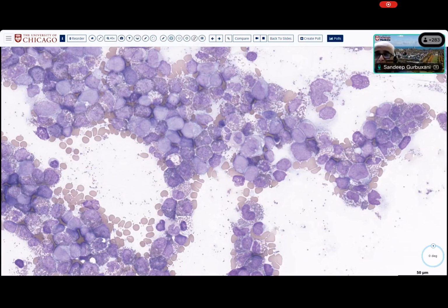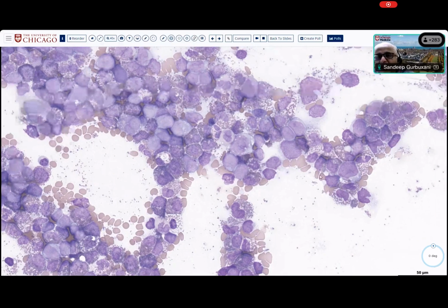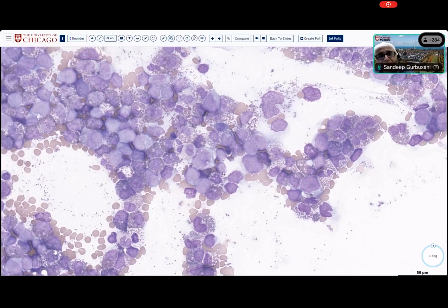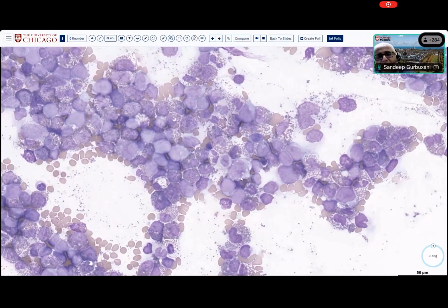And then one last question, and then we'll move to higher magnification and try and get to a better answer as to what this is. Any thoughts about what this cell might be over here? So it looks more similar to a dysgranulopoietic myeloid cell, but I can't be sure. You can't be sure because maybe we're not in a good part of the smear. Things don't look very well granulated. But I'm going to just keep pushing a little bit because I think it's good to try and review the material here. Any thoughts about this cell?